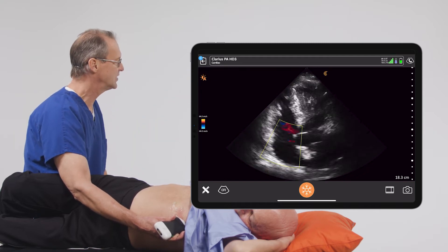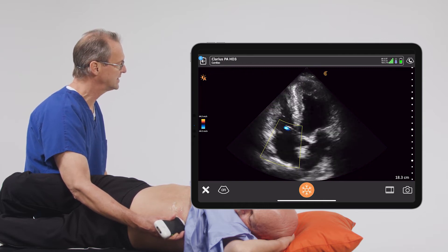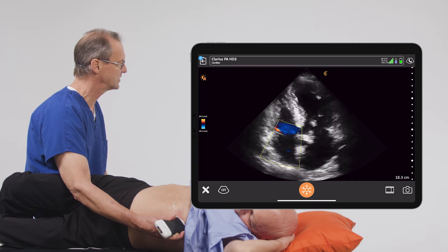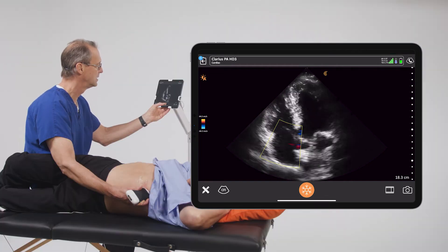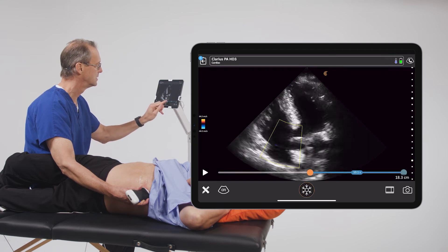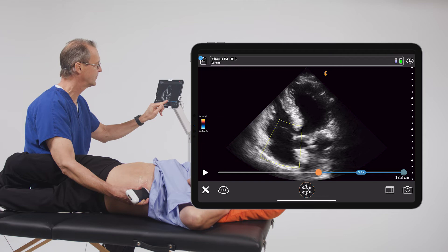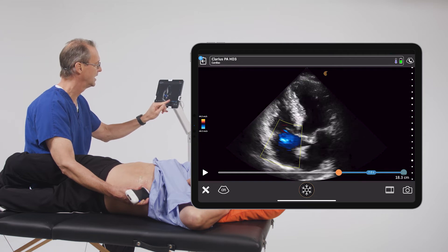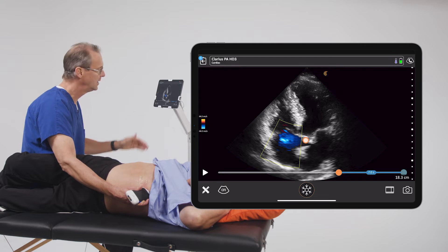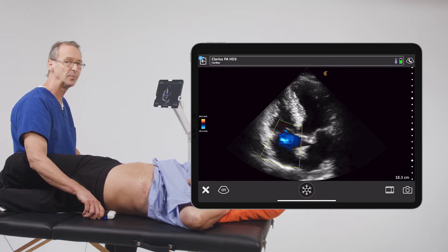Now we're going to focus our attention on the right atrium and look to see if we see any evidence of tricuspid regurgitation. When we do that, we can freeze the image. And we see right here this blue color doppler image in the right atrium.